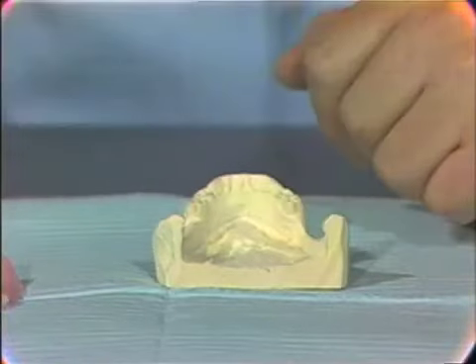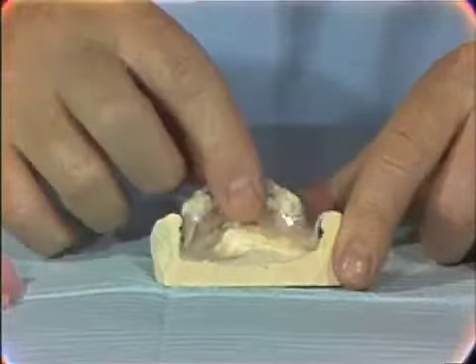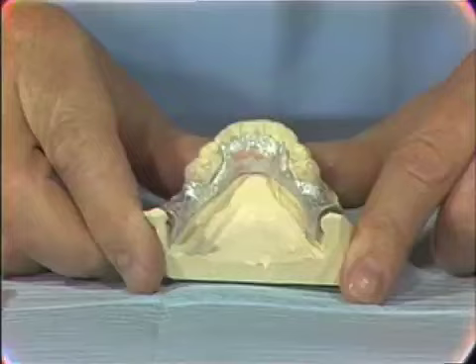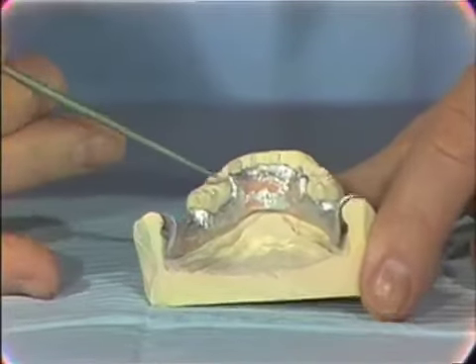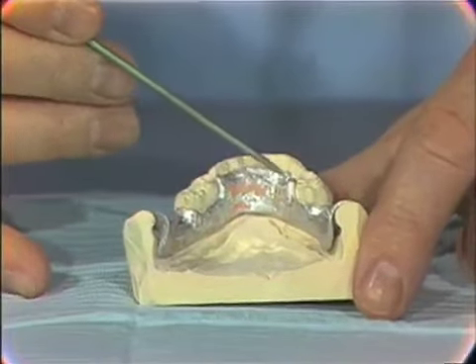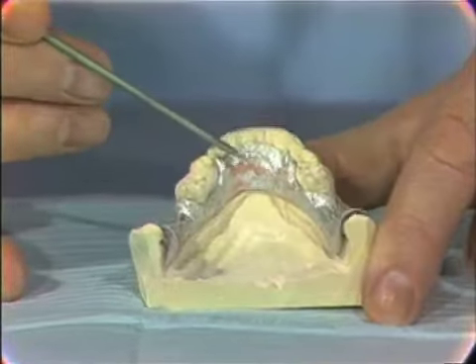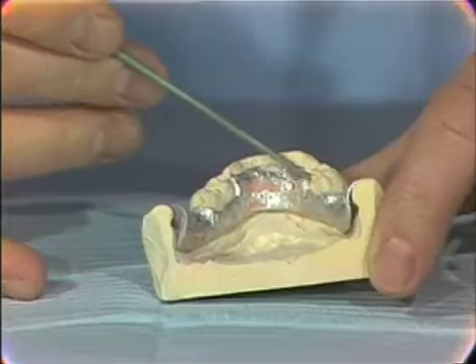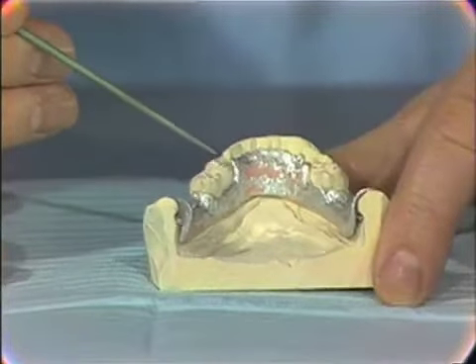This can best be accomplished from aluminum. A tray that was previously designed and used to take an impression on this patient, you see here. This is another modification to give rigidity. It's carried upon the teeth. We want to come up on the necks of the teeth a little bit so we can get the position of the tissues in relationship to the teeth. Also, make this lingual bar wide all the way around here so that you can carry enough impression material to the mouth.